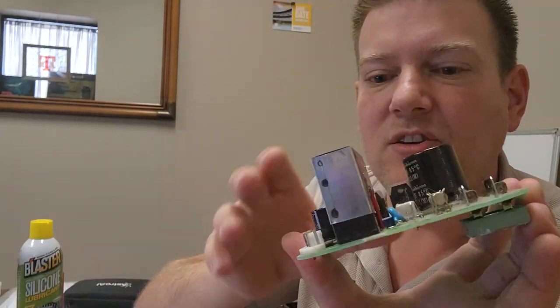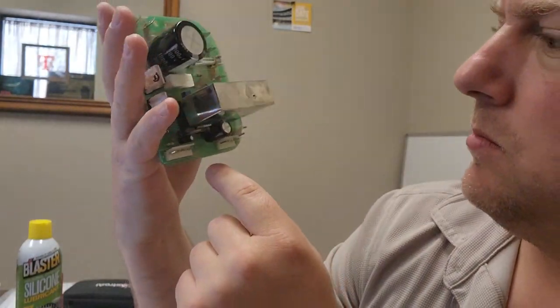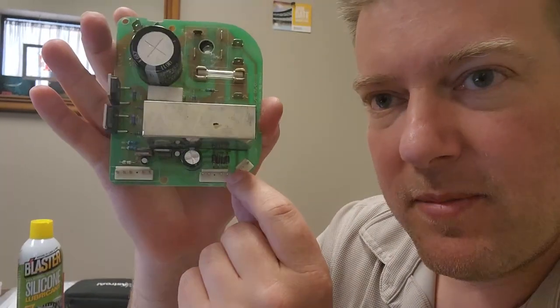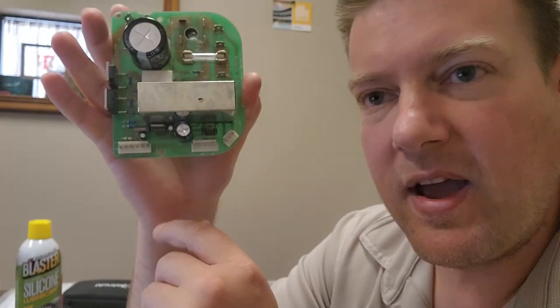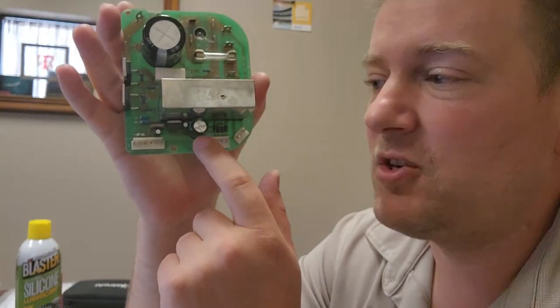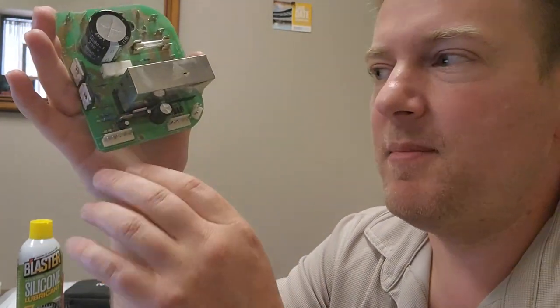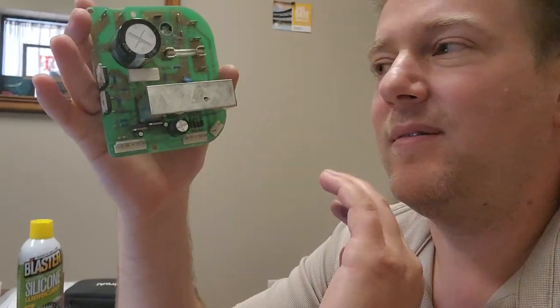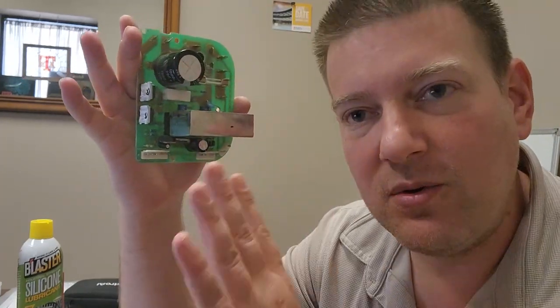Now this over here, this is another power circuit, and I can show you, here, let me just pull that component out. So over here, you can see that I have my 12-volt AC that comes off the transformer, it comes in, and from there you can see I've got 4 diodes. So it creates another little power phase. So it's 12 volts AC in, they go across 4 diodes, and now you got DC. Here is your large capacitor for that DC rail, and then it uses that DC and it comes out on this port to wherever. Doesn't really matter. So this is basically a whole other circuit, and it does tie into this a little bit. It might power the brain box in here. Not really sure. Doesn't really matter at this point, because since this is clicking the SCRs on right here, I knew that it was working.